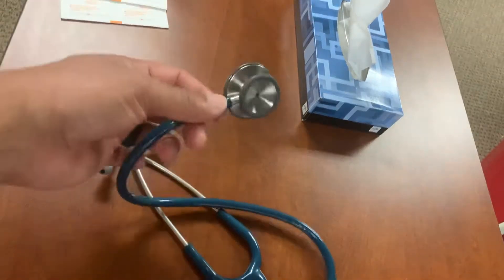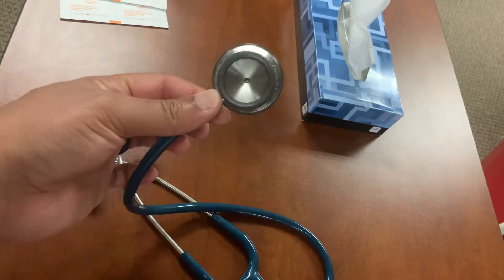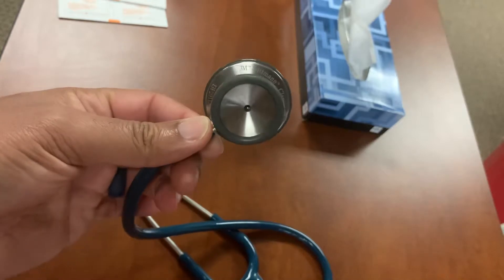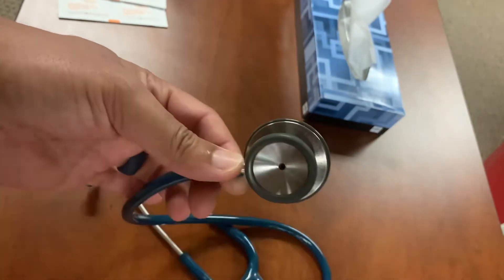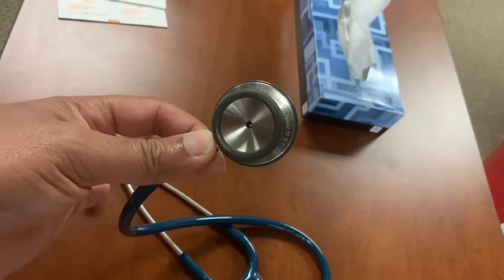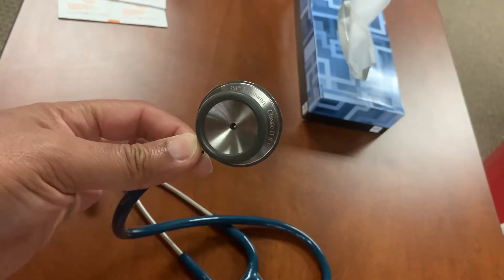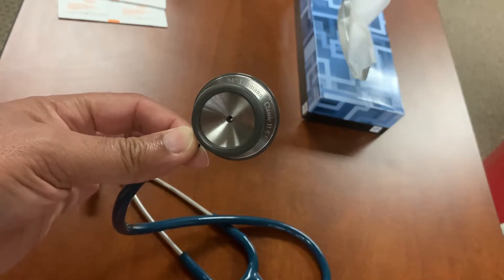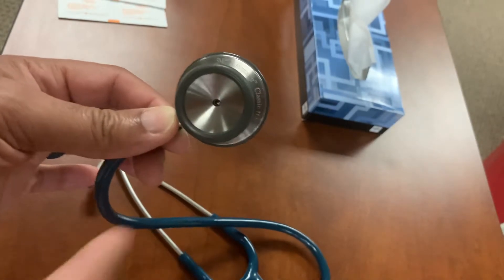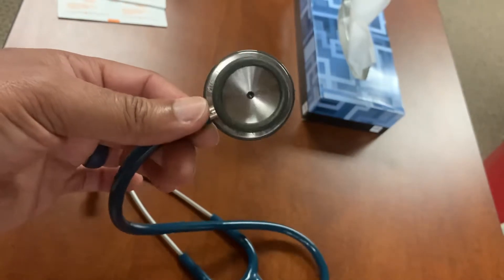I'm a starving nursing student in an LVN to RN program, and my trusty Littmann Classic II had a stuck bell. I was about to go listen to a patient that was on a ventilator — patients on ventilators have really interesting breath sounds. The ventilator takes over to the point where you can barely hear the patient's apical pulse. So my teacher said, how about you turn your bell so you can listen to the heart sounds better? Well, I couldn't do it. It was stuck.